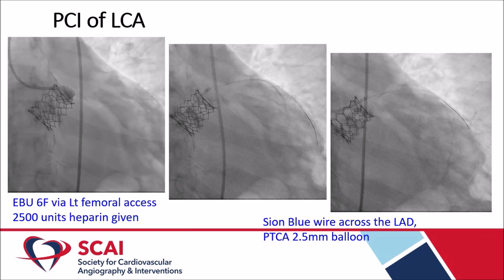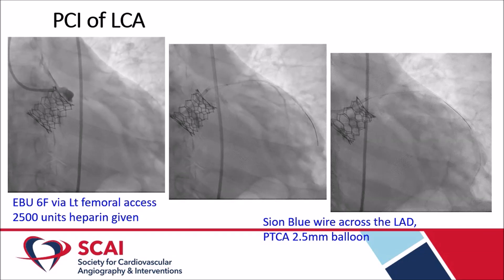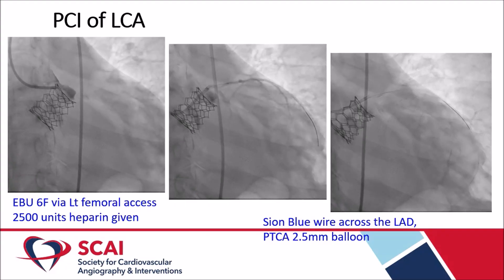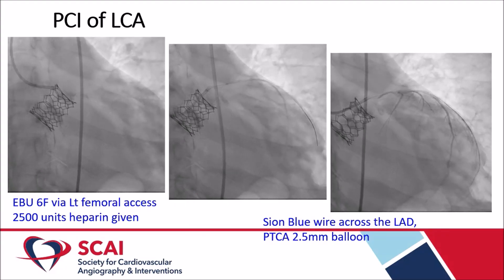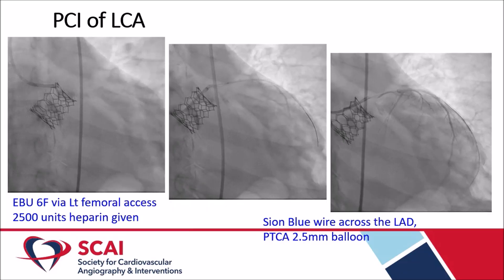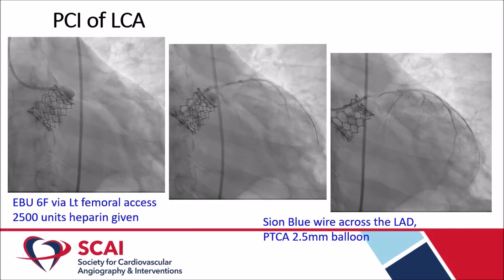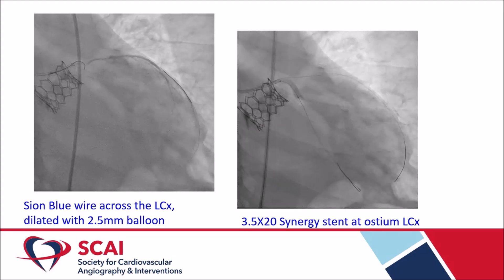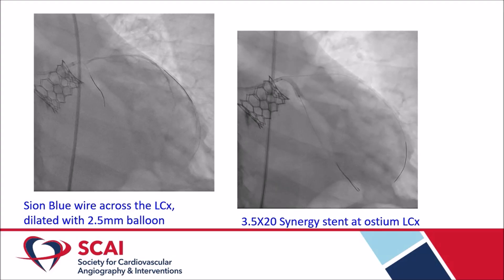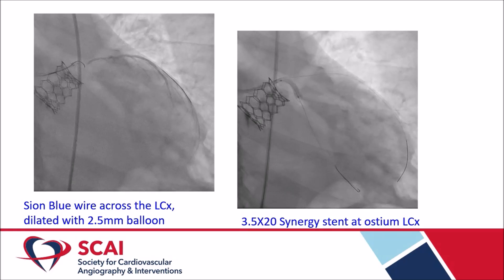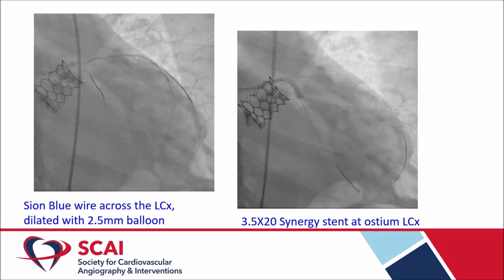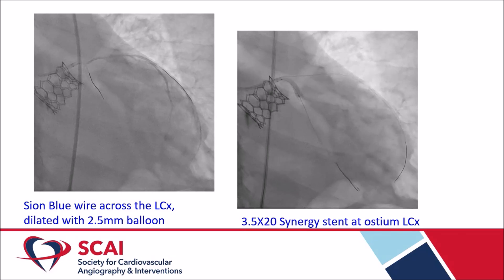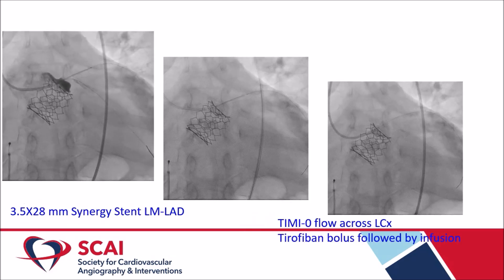A 6F guide from the left femoral approach was used. Additional heparin 2500 units was given. A Sion Blue wire was used to cross the left LAD, which was dilated with a 2.5 mm balloon. The LCX was also rewired with difficulty.